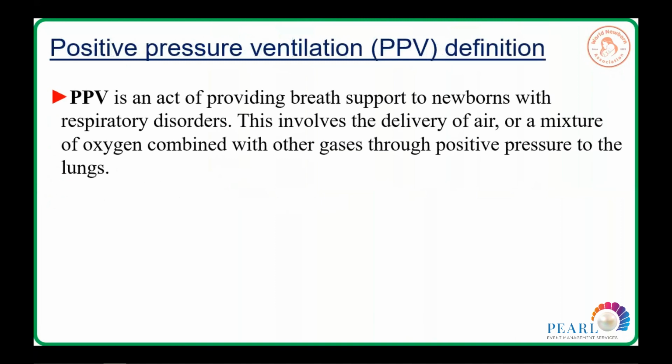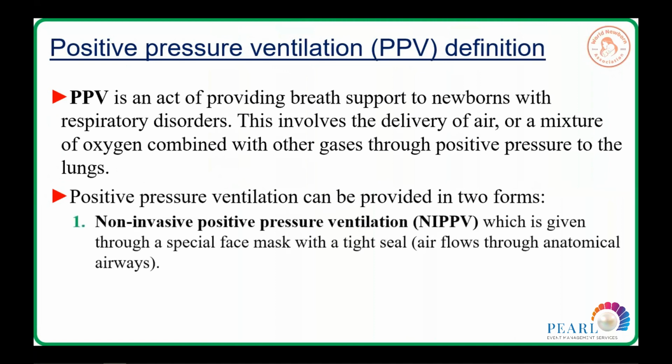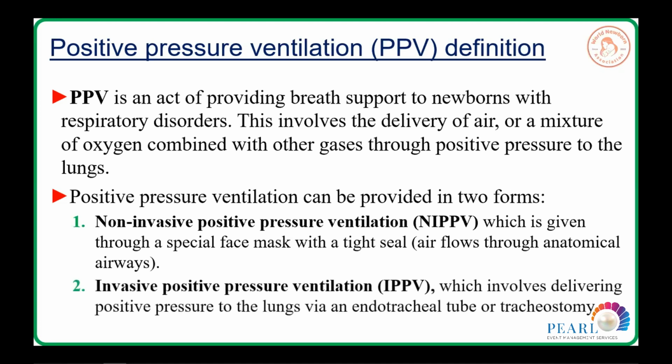Positive pressure ventilation is an act of providing breath support to the newborn with respiratory disorder. This involves delivery of air or a mixture of oxygen combined with other gases through positive pressure to the lungs. Positive pressure can be provided in two forms. Non-invasive positive pressure ventilation is given through a special face mask with tight seal. Air flows through the anatomical airways. Invasive positive pressure ventilation involves delivering positive pressure to the lungs via an endotracheal tube or tracheostomy.